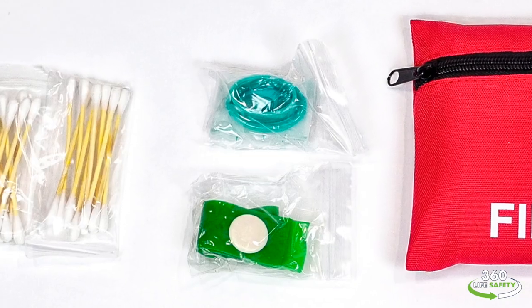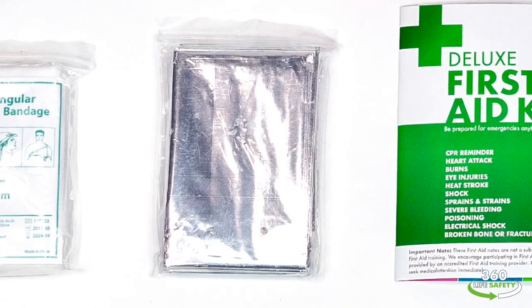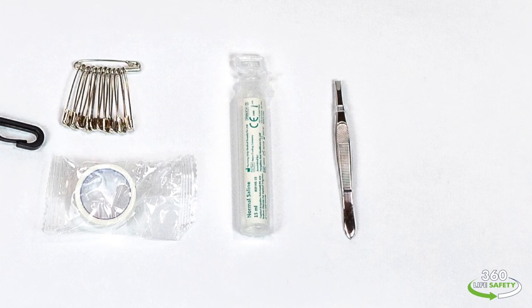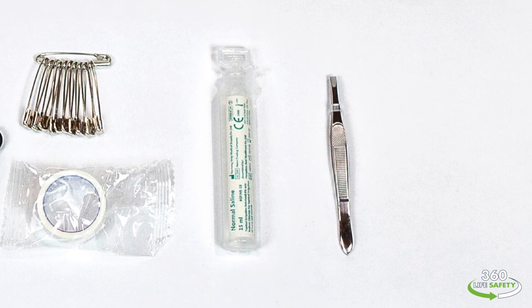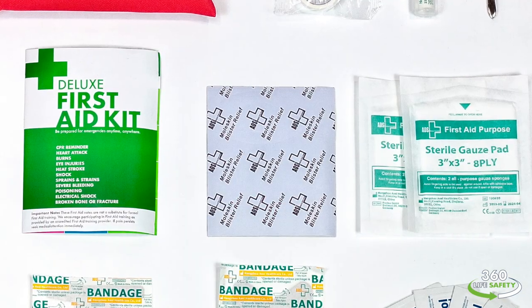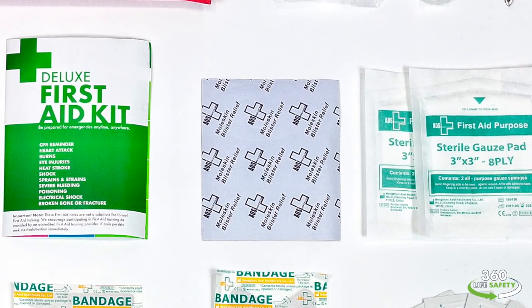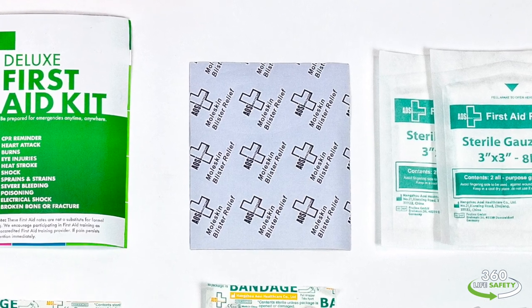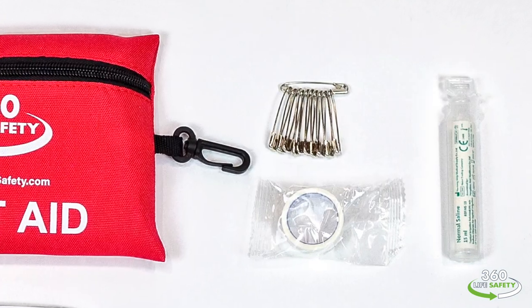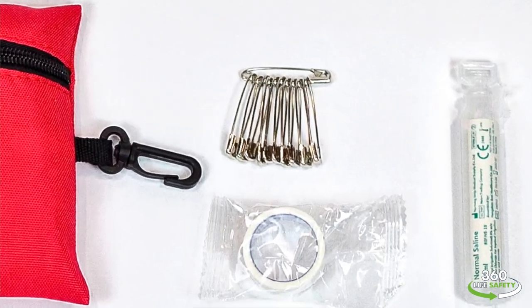Some additional features that this kit carries is a CPR face shield and an emergency blanket. It also comes with an eye wash, which is wonderful in case someone gets something in their eye. A pair of tweezers for those difficult splinters you just can't get out with your nails. It also comes with one of my favorite products, a moleskin blister cover, perfect for when you get one of those blisters in a difficult area a band-aid just won't stay on. It even comes with an assortment of safety pins.